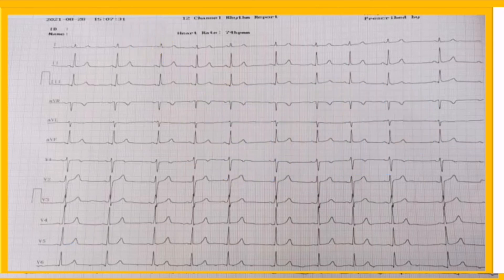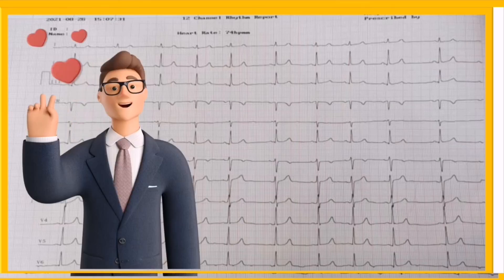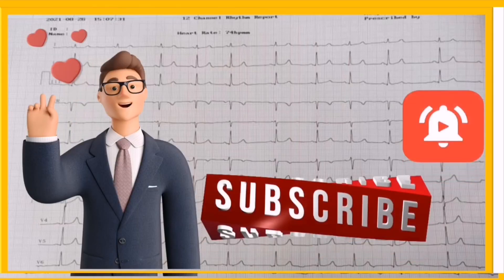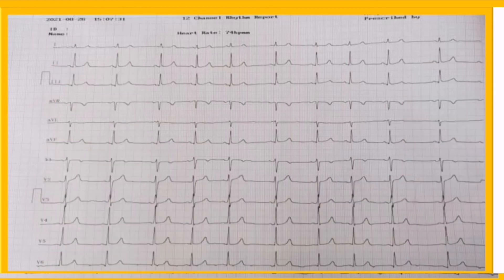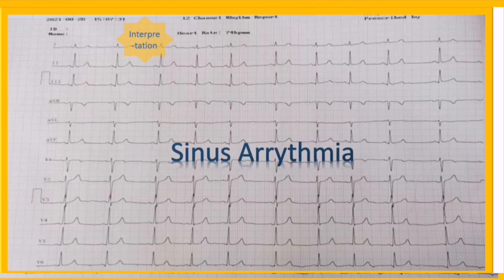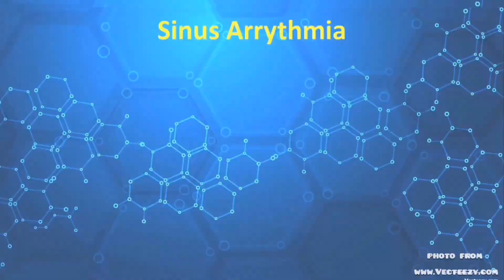Our last step is overall interpretation. To interpret our EKG properly, we are supposed to make a list of abnormal findings. In this strip, the only abnormal finding we have is the irregularity in heart rhythm. Therefore, our EKG shows sinus arrhythmia. Let's have a brief overview of sinus arrhythmia and its clinical significance.